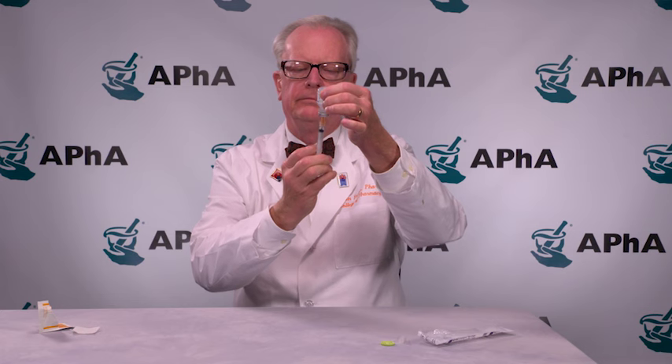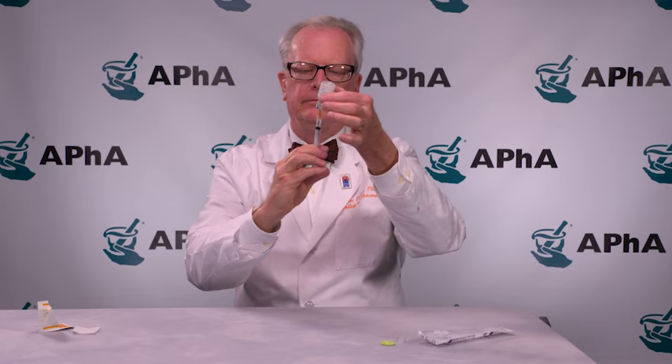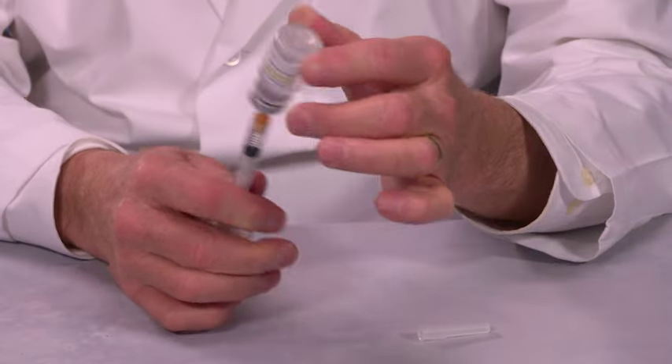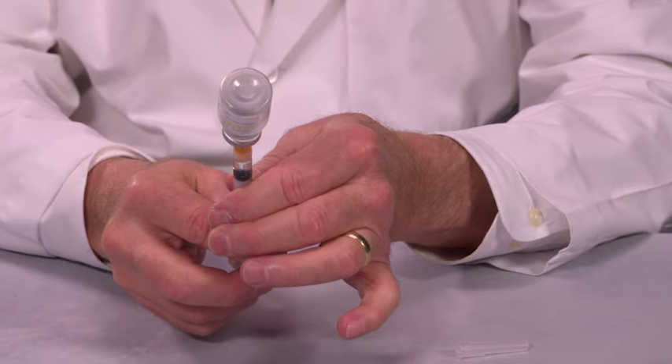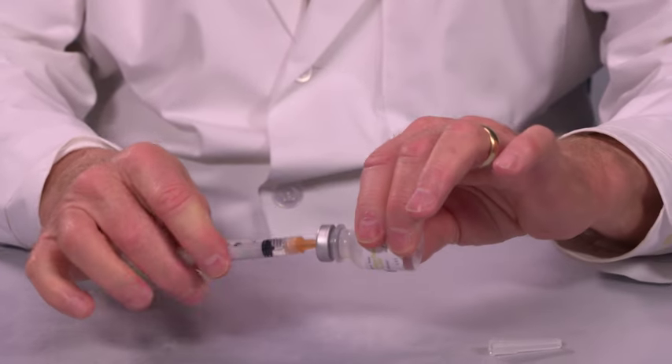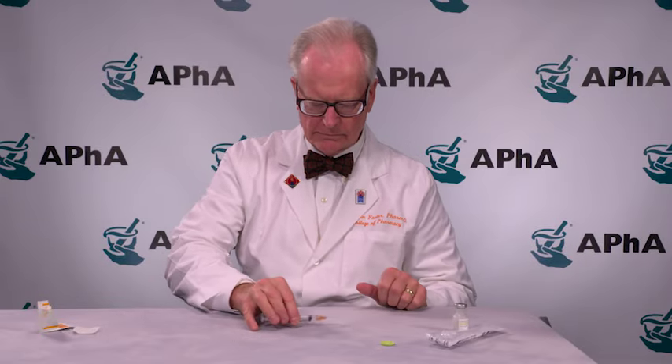Insert the needle through the stopper at the top of the vial. Inject the air. Invert the syringe and vial and withdraw the required amount of vaccine. Remove any large air bubbles. Once you have the correct volume of vaccine in the syringe, remove the needle and syringe from the vial. At this point, you can do one of two things: recap the syringe for later use or inject the vaccine directly into the patient.